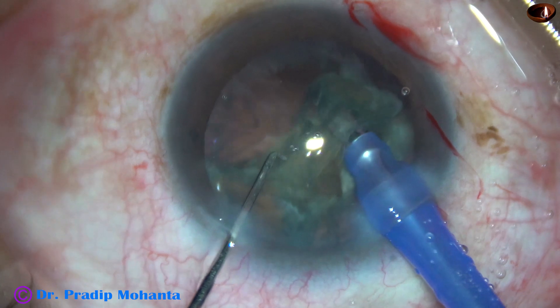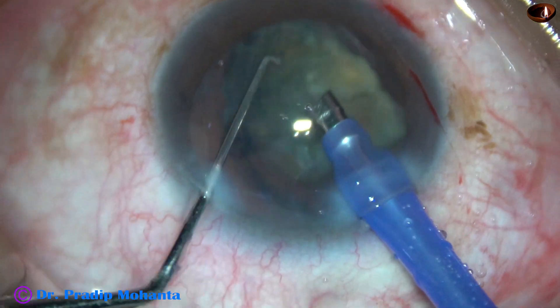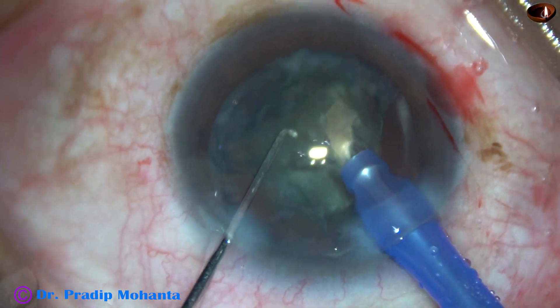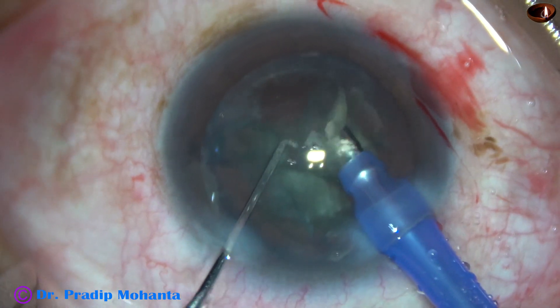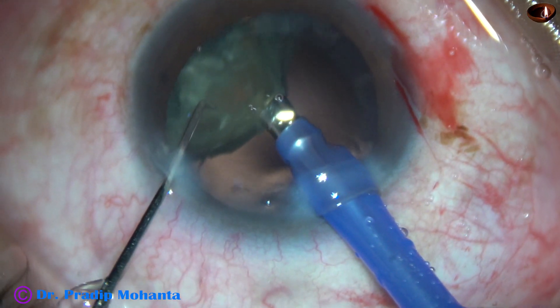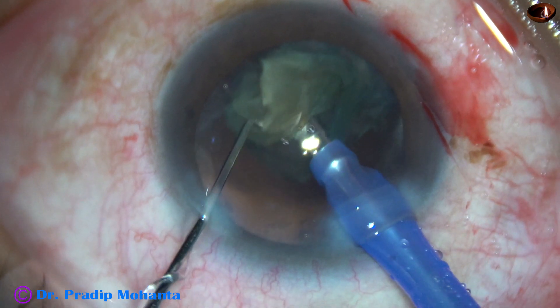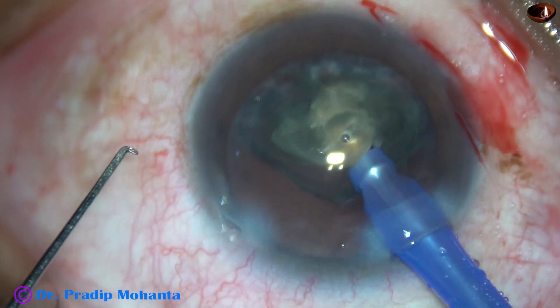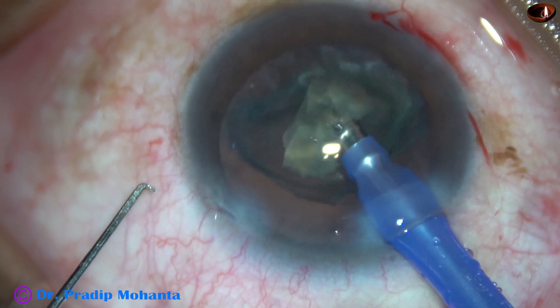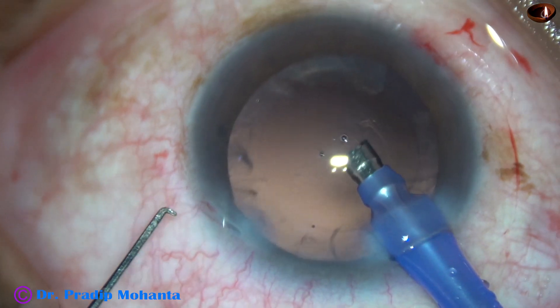Now this is towards the end of the nucleus management. The final nuclear fragment is being divided into smaller pieces. Now I remove the chopper to make the anterior chamber more stable. As soon as I remove the chopper, leakage from the side port stops and the anterior chamber becomes more stable.